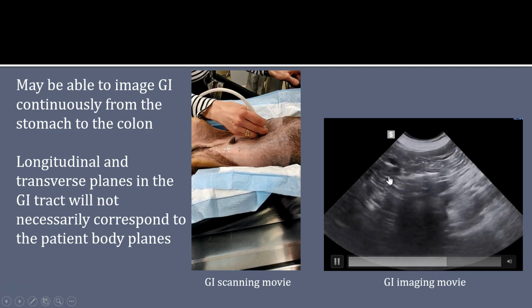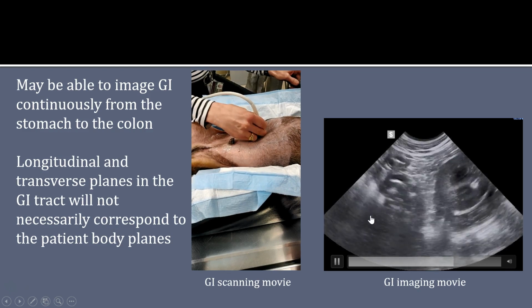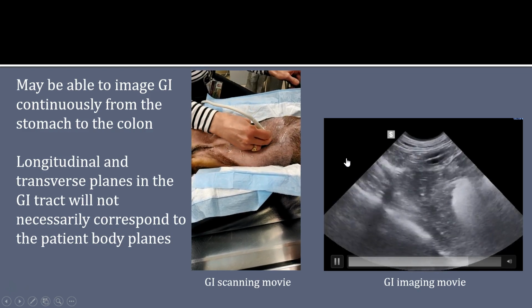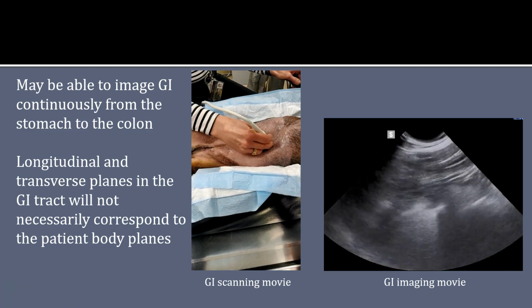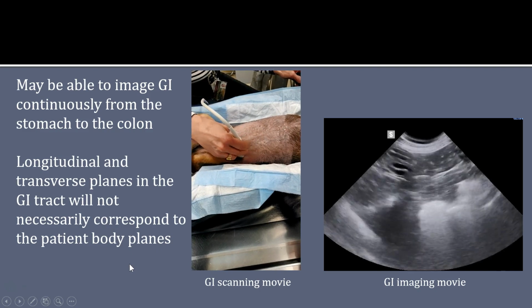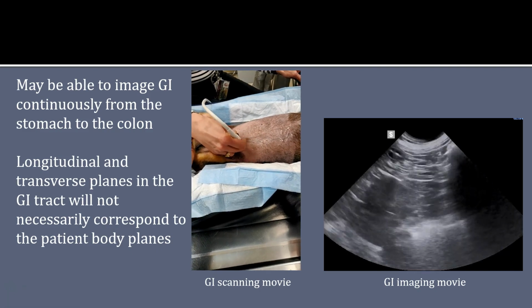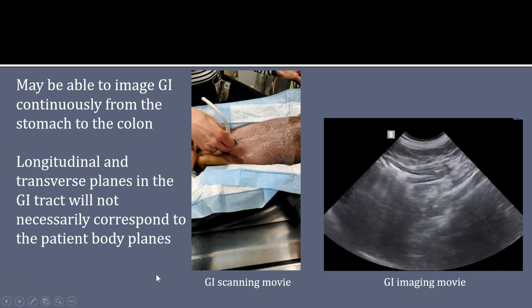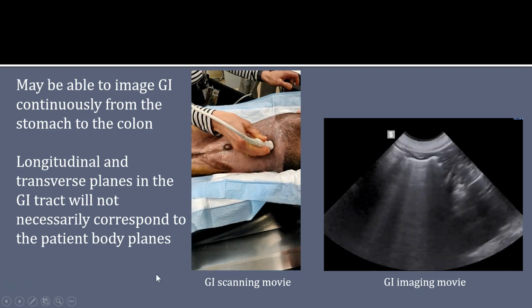Ascending duodenum, then I curve into a jejunal segment, and again, sometimes you'll see that I lose it and I have to go back again, and I'm not necessarily doing both long axis and transverse on any specific segment. Now, if I did identify an abnormality or if it was diffuse, I would stop and take those longitudinal and transverse plane images.